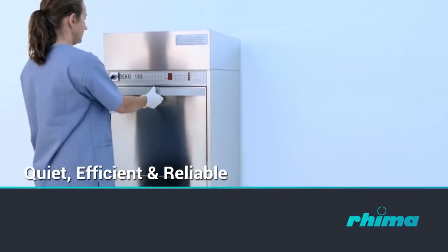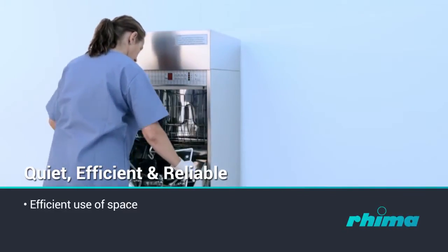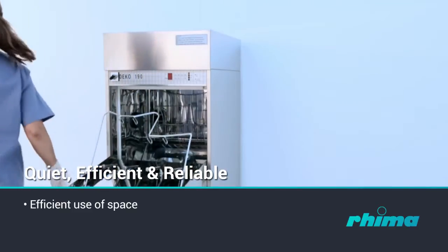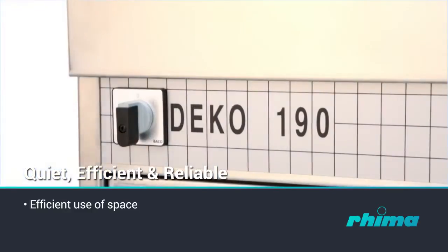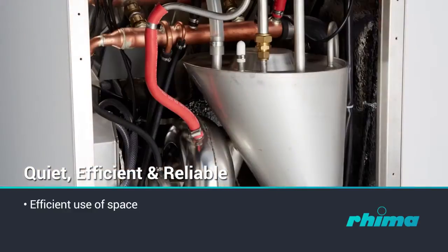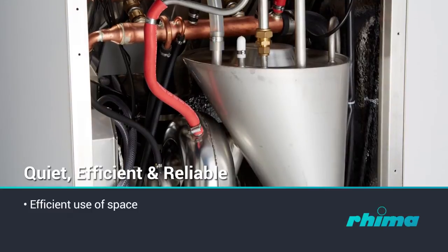The Deco 190 occupies its space efficiently. The unit requires only 600 millimetres wide by 630 millimetres deep of floor space. Connections to water, electricity and drain are provided with all the necessary safety features.